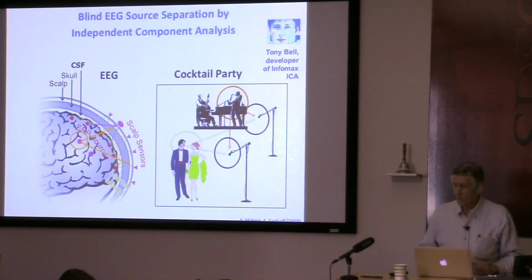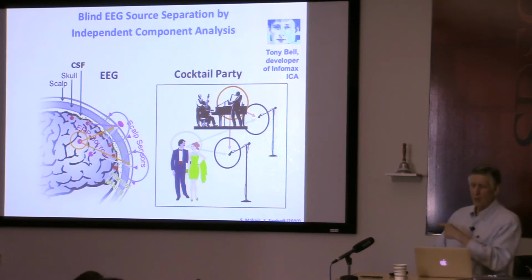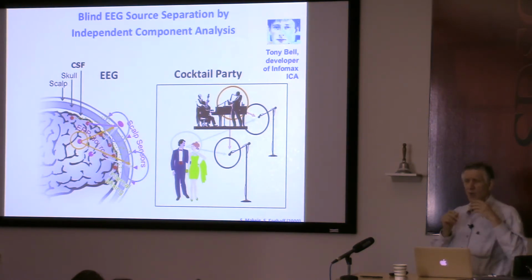So the same goes for the EEG, that you have different sources acting mainly independently, projecting instantly to the electrodes and summing exactly linearly at the electrodes. So in this sense, the brain problem is actually easier than the acoustic problem. In the acoustic problem, you have finite propagation velocity, right?